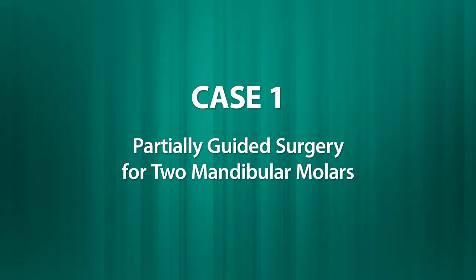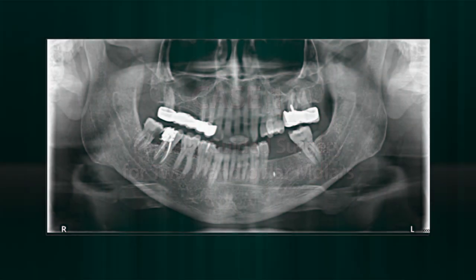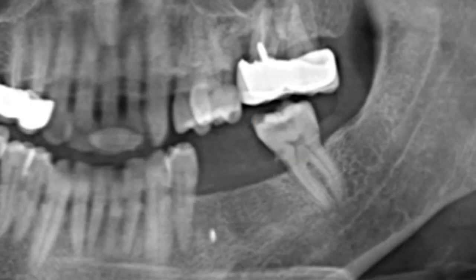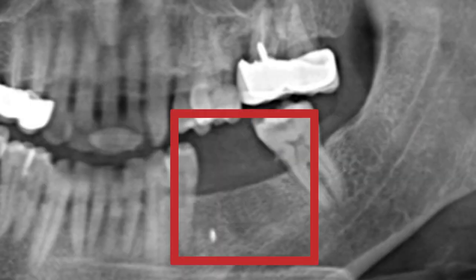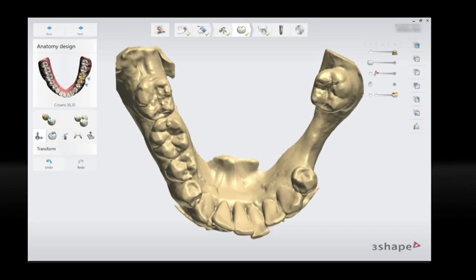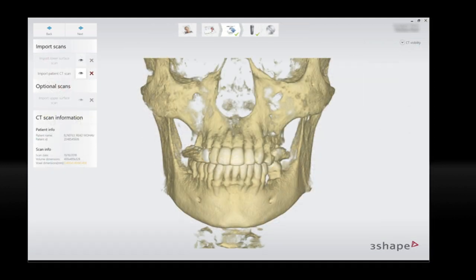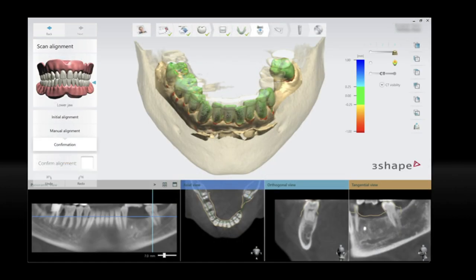In case number one, we have a 50-year-old male patient who is medically fit and well, who presented to replace missing teeth number 35 and 36. The workflow involves importing the STL, then a digital wax-up to proceed with a prosthetically driven treatment plan, importing the patient's CT, and surface registration of the CBCT and the STL of the patient.